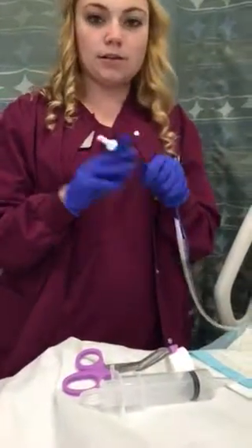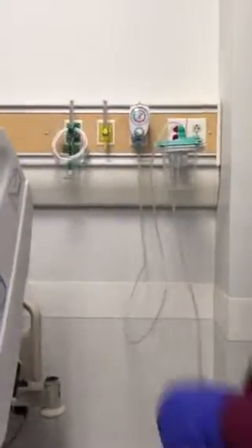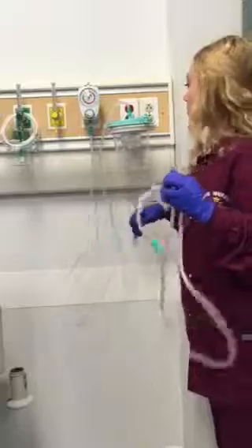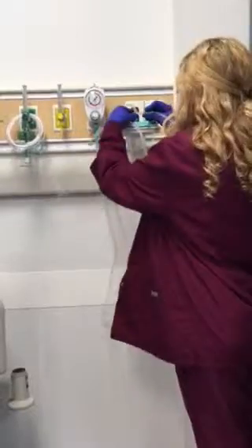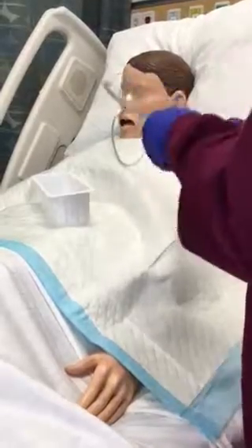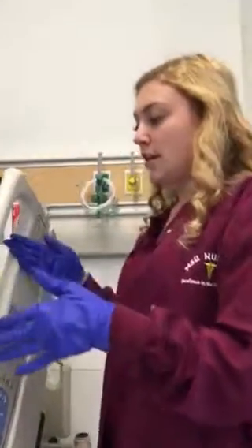Now I'm going to set it up with suction. So I put this end on here to relieve any gas that's in there. I've set up this tubing. I put it on low intermittent suction, and I've checked all the tubing for any holes or leaks or problems. Okay. And then I'm going to attach this end to my patient. And then before I set her up for suction, she's going to go to X-ray and make sure that it's in the correct place.